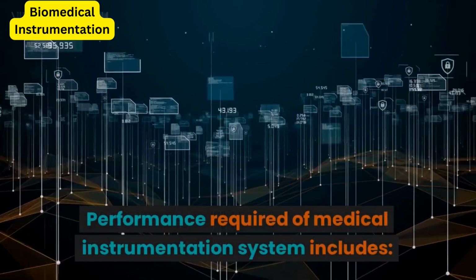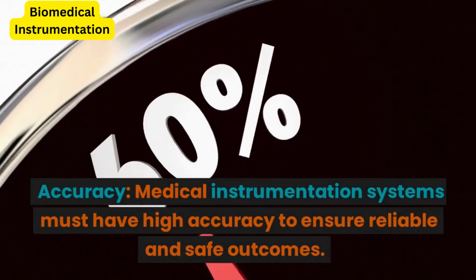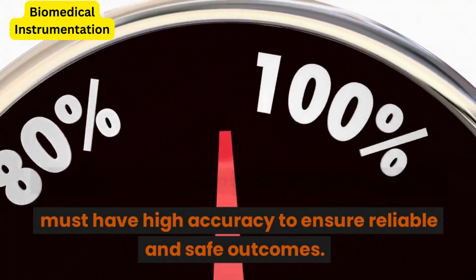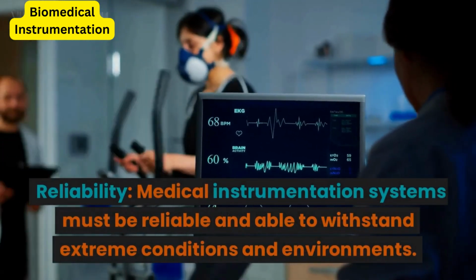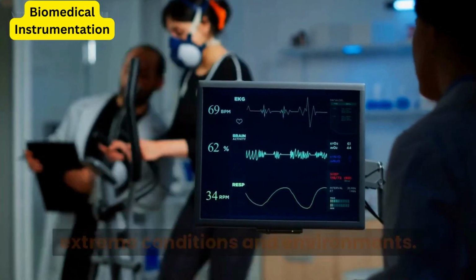Performance required of medical instrumentation system includes accuracy. Medical instrumentation systems must have high accuracy to ensure reliable and safe outcomes. Reliability. Medical instrumentation systems must be reliable and able to withstand extreme conditions and environments.